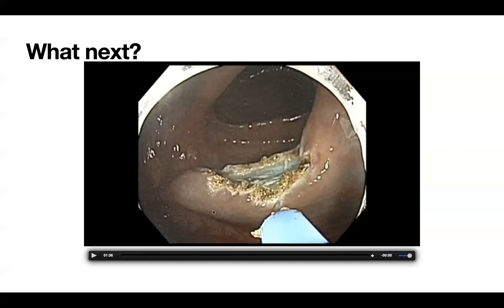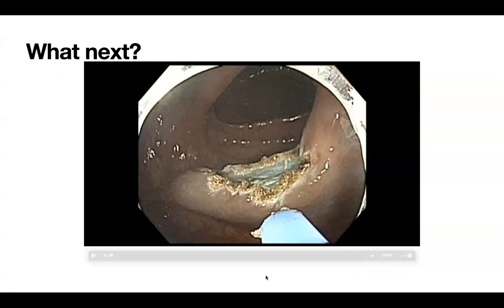Although the cut looked like en bloc, I always ablate the edge so as to cut down the risk of recurrence. And Roy and myself, we pooled our data of sessile serrated adenomas and published that even large resections, 20 millimeters plus, you can have a very low recurrence rate if you follow the protocol of ablating the edges.